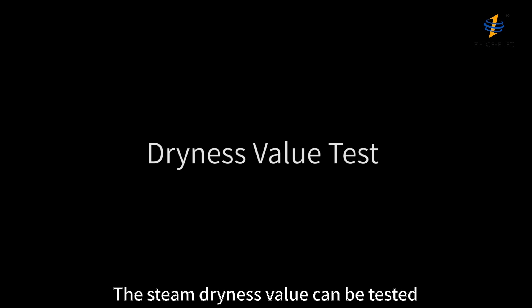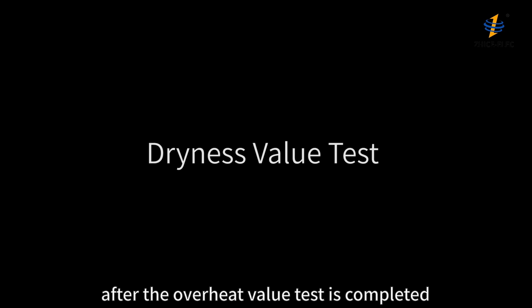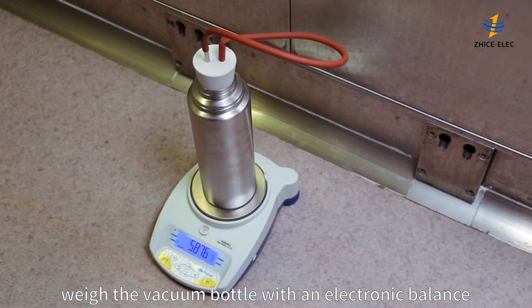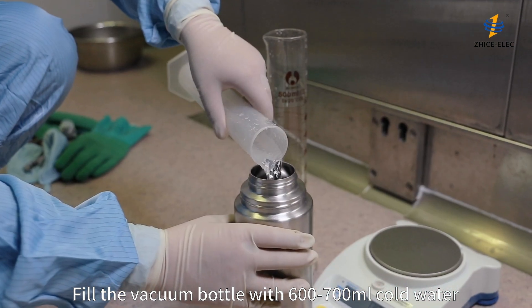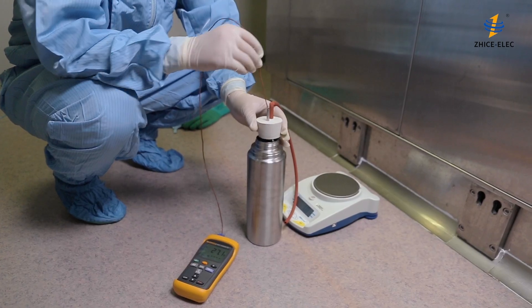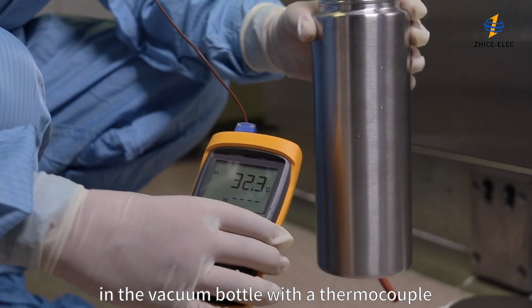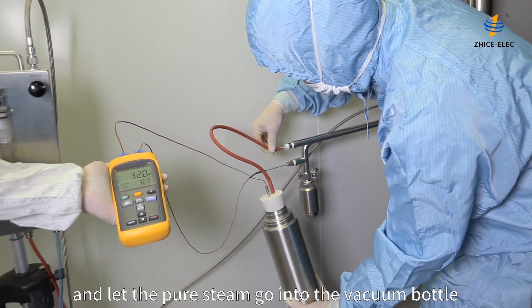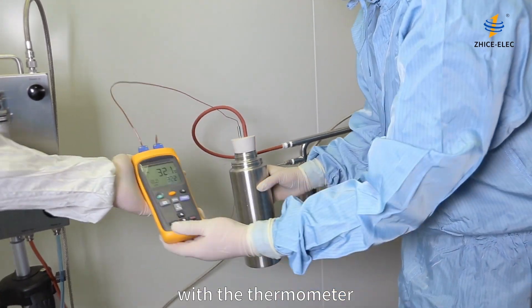The steam dryness value can be tested directly at the same testing point after the overheat value test is completed. First, weigh the vacuum bottle with an electronic balance and record the data. Fill the vacuum bottle with 600–700 ml of cold water, then weigh the bottle again and record. Measure and record the temperature of the cold water in the vacuum bottle with a thermocouple. Connect the rubber hose to the pitot tube and let the pure steam go into the vacuum bottle, monitoring the water temperature with a thermometer.